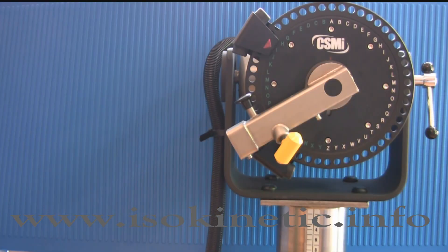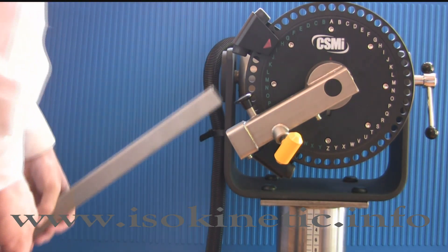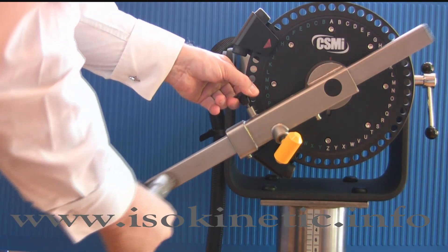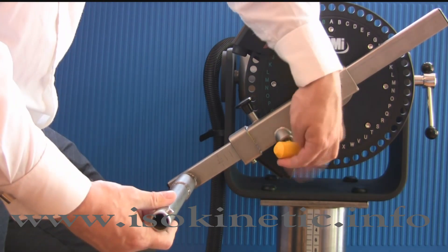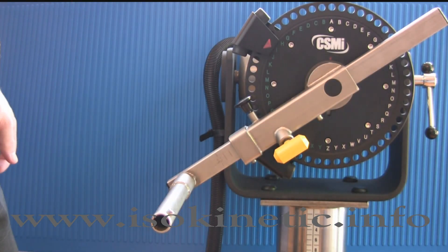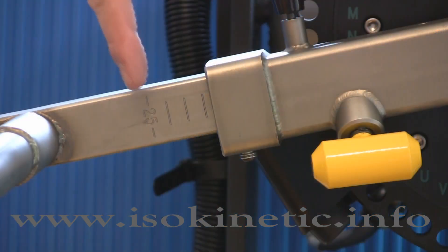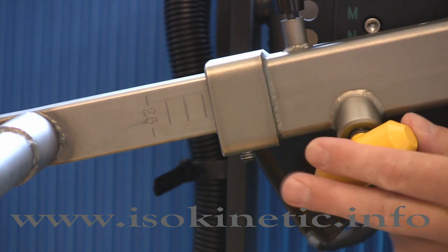Now install the knee hip adapter. Place the adapter into the long end of the input arm. Pull the locking pin to allow the adapter to fully enter the arm, then tighten the locking handle to secure. The position of the knee hip adapter can be read off the lower edge of the input arm. Top tip: when applying the adapter for knee tests or exercises, start by setting it too high, as it is easier to lower onto the ankle.